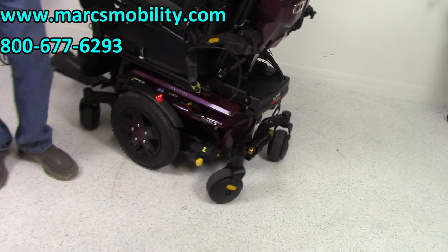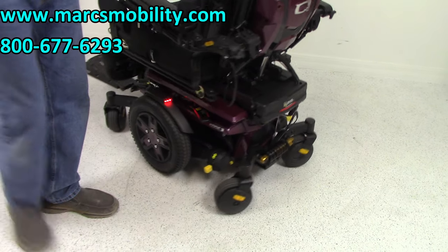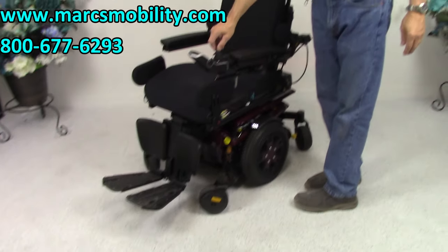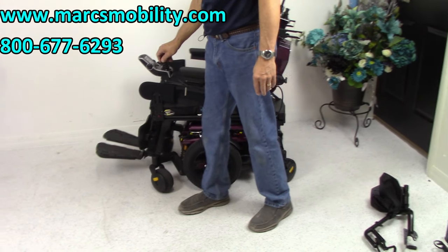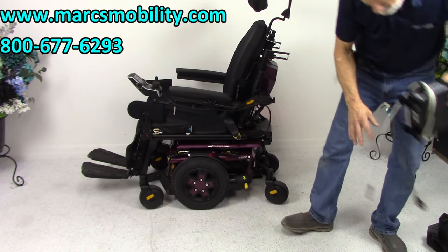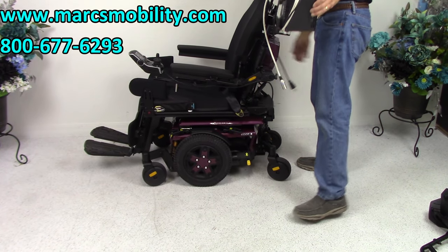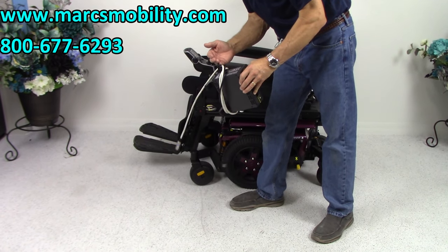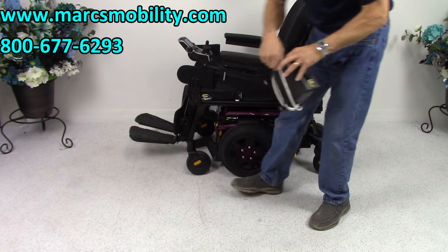So you have headlights and rear lights. When you charge this chair, you'll take your charger and plug it right into the front of your joystick. As soon as the light turns green on your charger, it'll stop charging — these are smart chargers; they know when to stop.